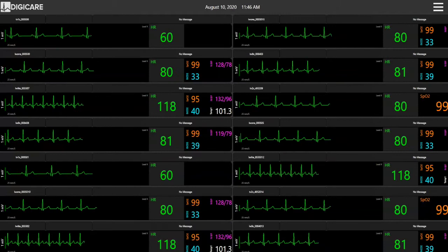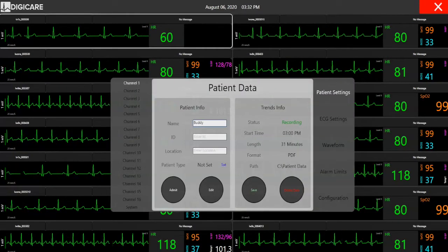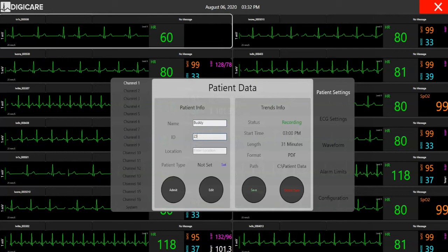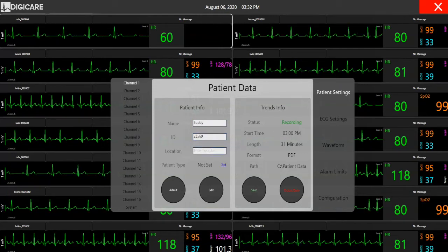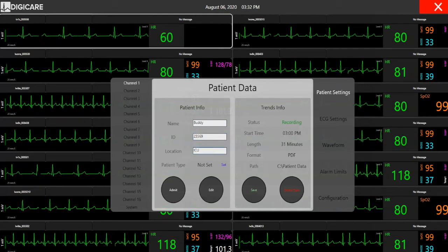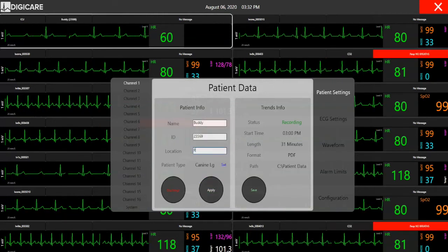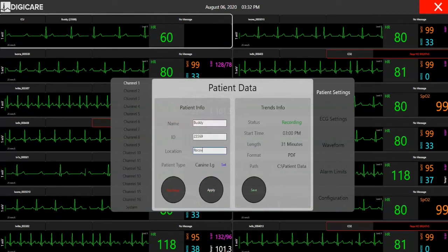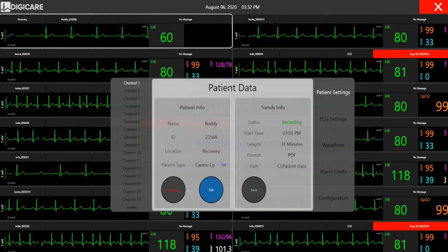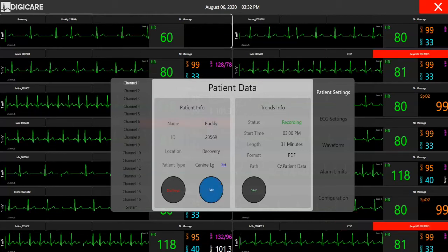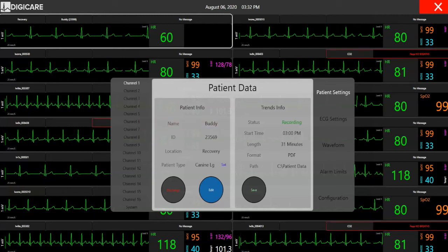Patients can be easily admitted and discharged through the Patient Settings screen. Patient type can be selected so the correct algorithms are utilized. Edits can be easily done for a patient by hitting the Edit button and making the changes needed. The Patient Settings screen also shows the trends information, including the status of the monitors.